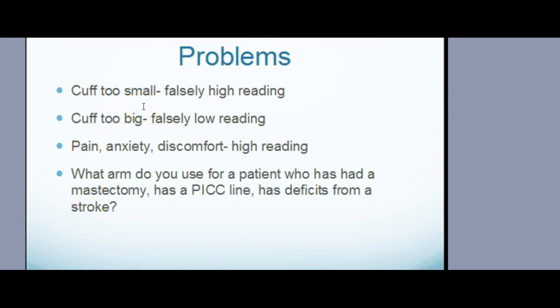Look, if the cuff is too small, look what happens. If the cuff is too big, look what happens. And then also, we can cause the patient pain. If we're pumping it too high, they get anxious, uncomfortable, and then we have a high reading. So we have to make sure that when we're taking a blood pressure, we've had this before in the past where a student took a blood pressure on the wrong arm.